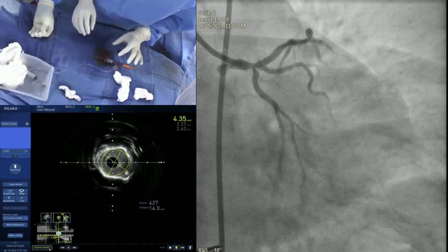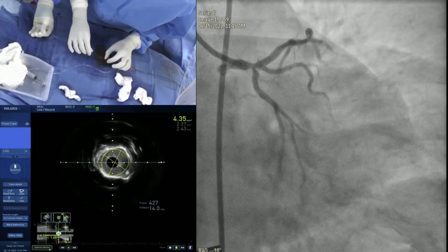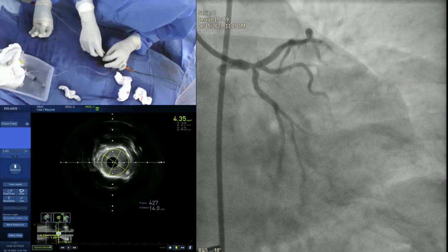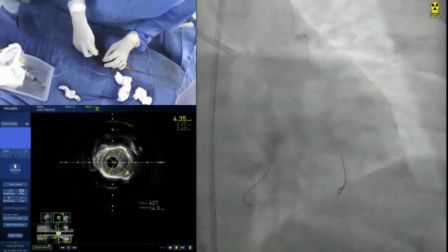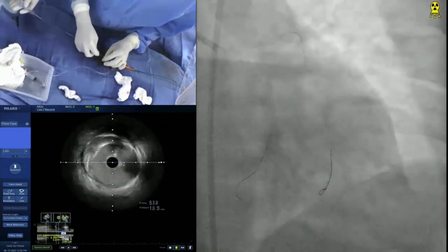So that's a decision we need to make. We have both ready, cutting balloon versus IVL. Technically, we don't have a cutting balloon, 375 cutter. Anyone would choose any ablative technique here or just go straight with stenting or ballooning?